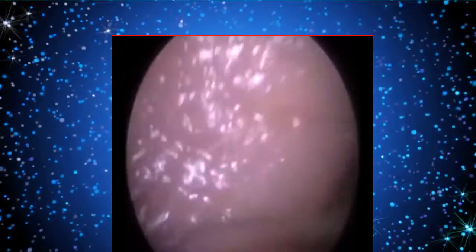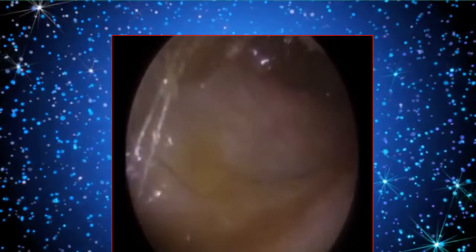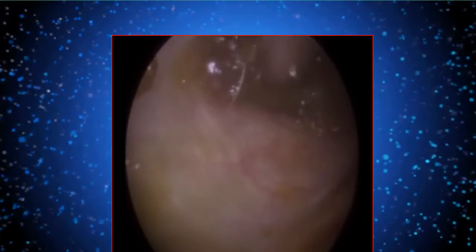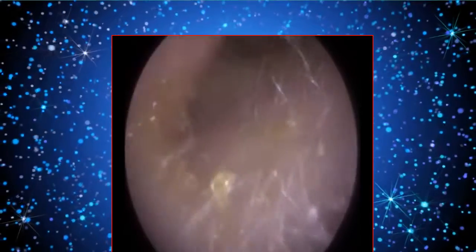So the endoscope is the device that's providing us with the view, and I'm holding that with my left hand, and with my right hand I'm going in with the standard size Zollner suction probe. And you can see there we were slowly releasing the soft layers of wax, and that was just a bit of wax quite medial against the eardrum. So that was a pretty straightforward procedure in the gentleman's left ear, and I'm just mopping up near the entrance, a bit of wax there.